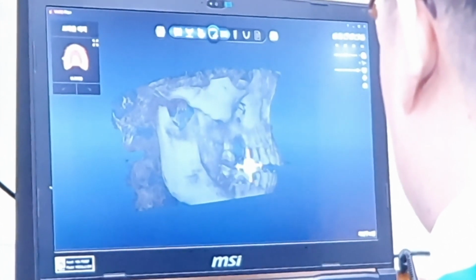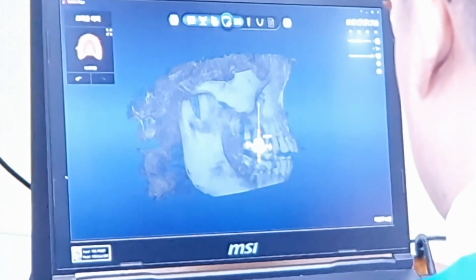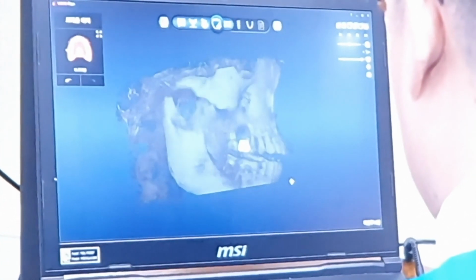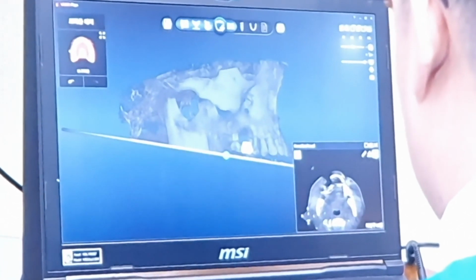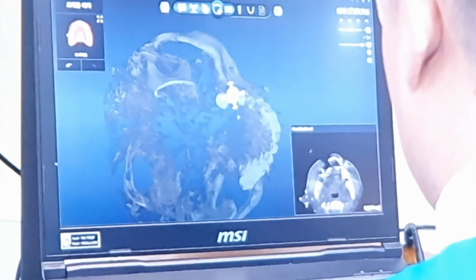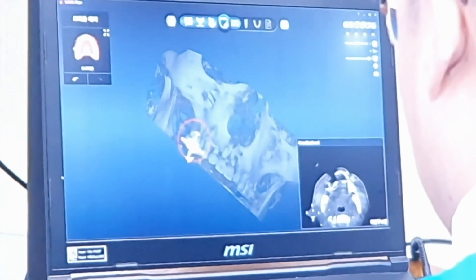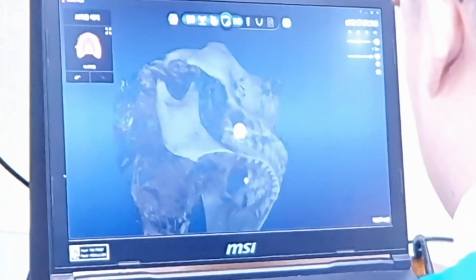So this treatment is a prosthetically driven, so-called top-down method. First positioning the crown and adjusting direction and angulation. With just one click of the DICOM file, the CT data is available. So we register a new patient. To see the tooth positioning from the occlusal surface view, we remove the mandible and only look at the maxilla. Here we check the position we want for the tooth, considering the prosthesis. Of course we can freely adjust the size and angle of the tooth in the software.